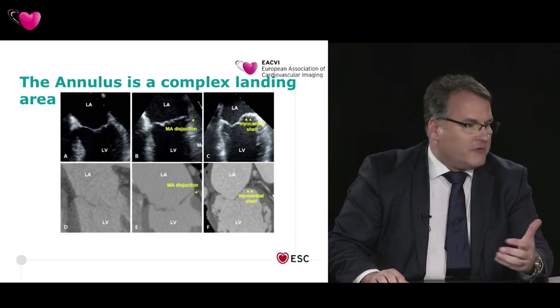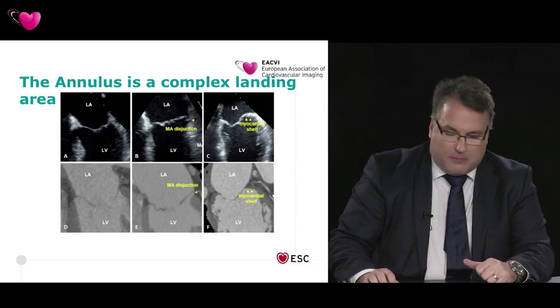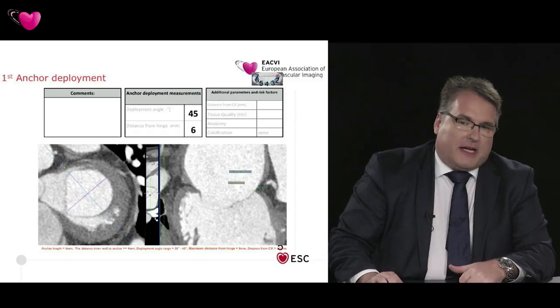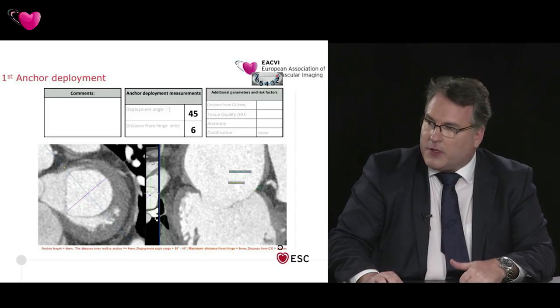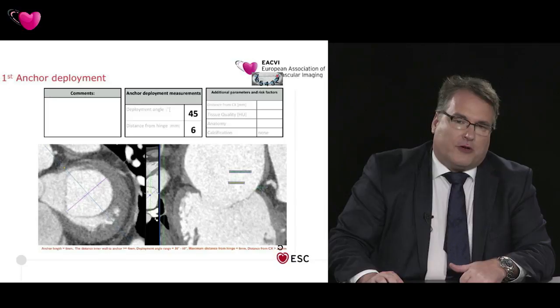And of course, photorealistic imaging and the light sources tell us also about the thickness by putting the light below. This gives us a very good impression of where we can reach the ventricle and how long the distance is between the hinge point and any vessel, like the circumflex artery and the coronary sinus, which we'll also see later.